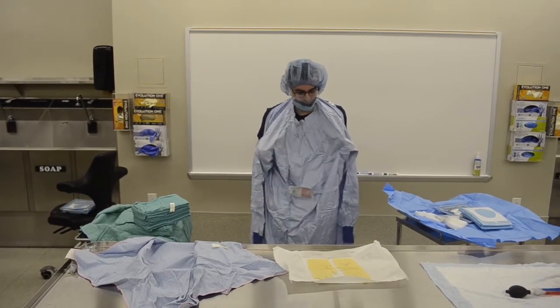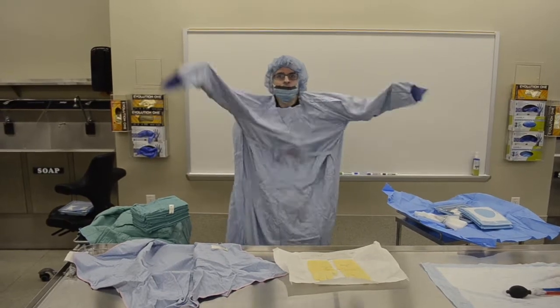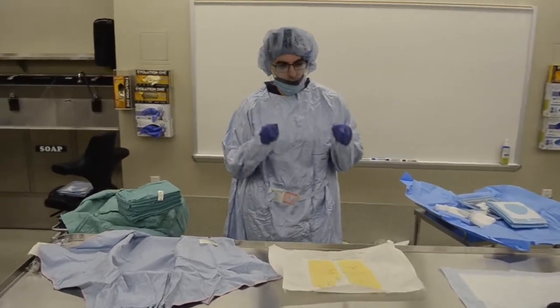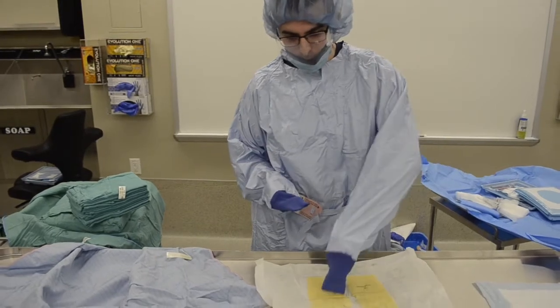Now your arms are still free. You can then slide your hands in yourself. Now make sure your hands don't come out the other end. Now you're ready to put your gloves on. So you have your gloves in front of you. First pick up one.